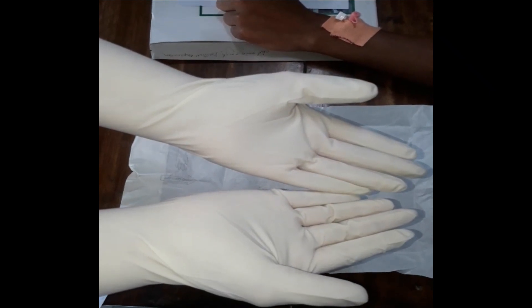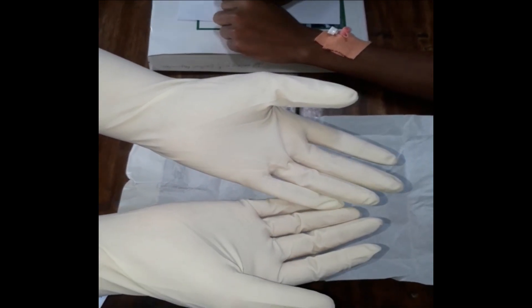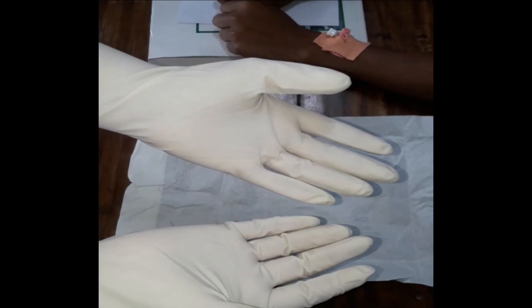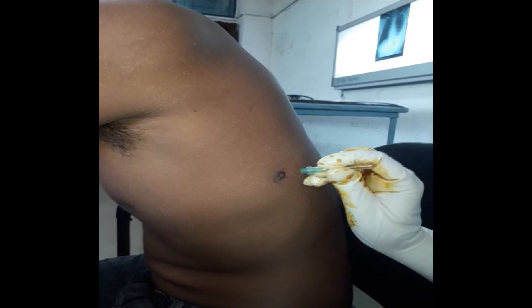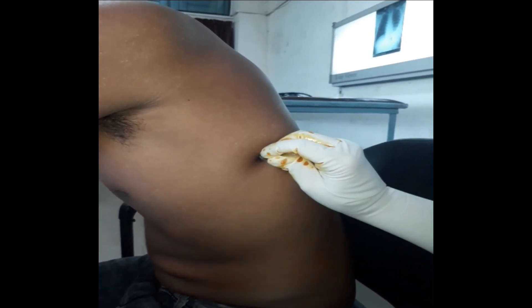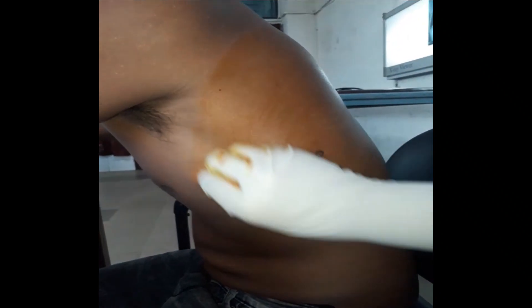We are using sterile gloves. The next step is maintaining asepsis and cleaning the area before the procedure. We will clean a large area from central to periphery. Before cleaning, we deepen the site marking with a cap so it cannot be wiped out. Now we clean the area with antiseptic solution starting from the center outward, not returning to the center. We let it dry spontaneously, then clean again.